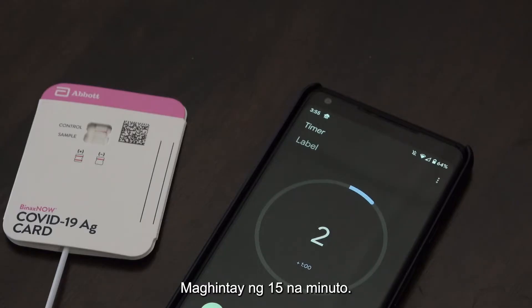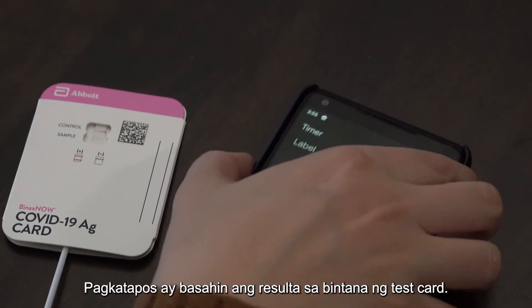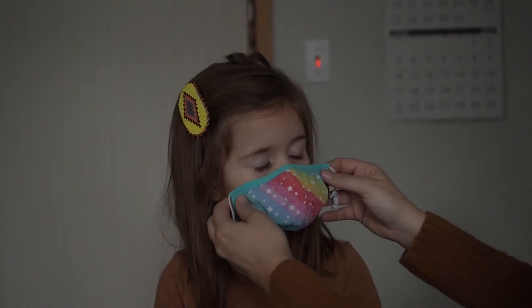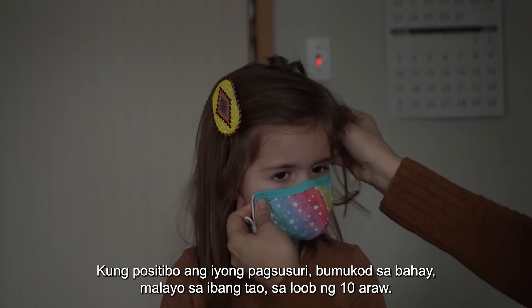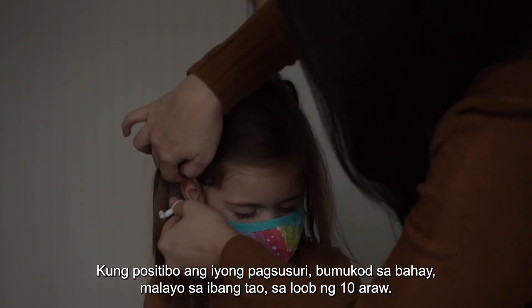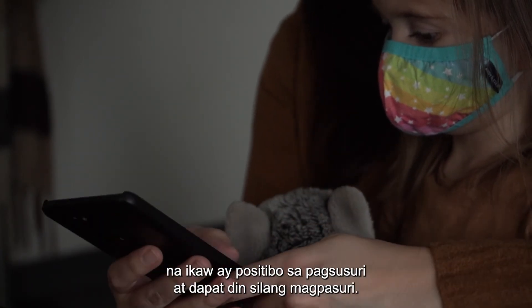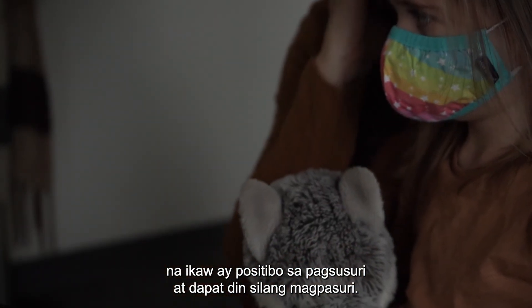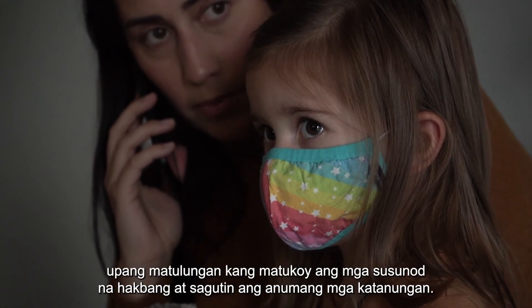Wait 15 minutes, then read the results in the test card window. If your test is positive, isolate at home away from other people for 10 days. Tell your household members and close contacts that you have tested positive and that they should get tested too. Talk to a healthcare provider to help you determine next steps and answer any questions.